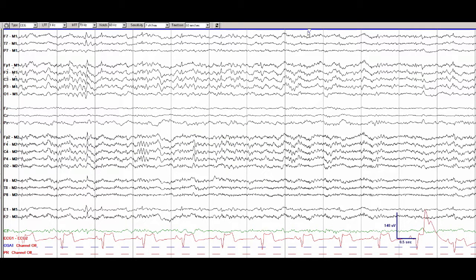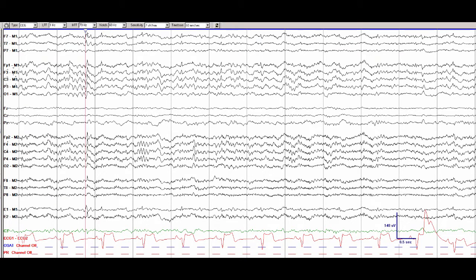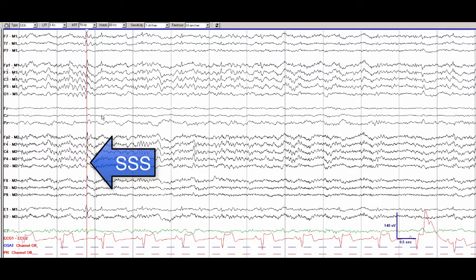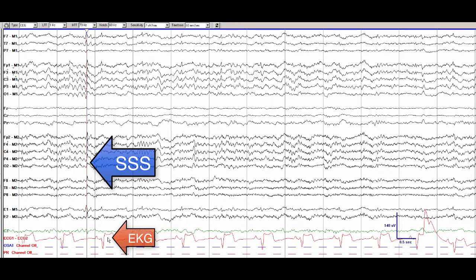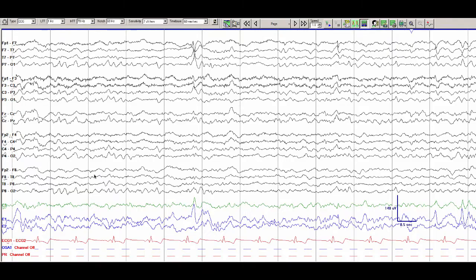Of note, these are easily mistaken for artifact from the EKG, but if we set up our cursor, we can see that this right-sided small sharp spike is nowhere near the QRS complex of the EKG lead.